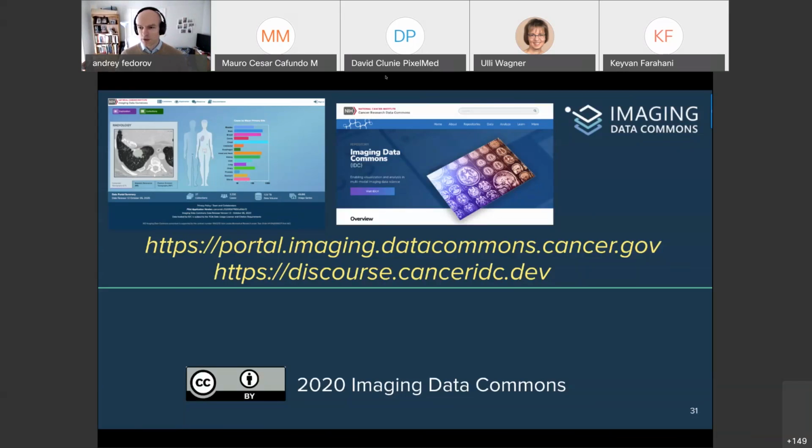And converters to and from DICOM whole slide imaging representation is one set of those tools. So there are already converters that can perform this task. As we embark on the conversion of the digital pathology data, we will test and refine those converters if applicable.